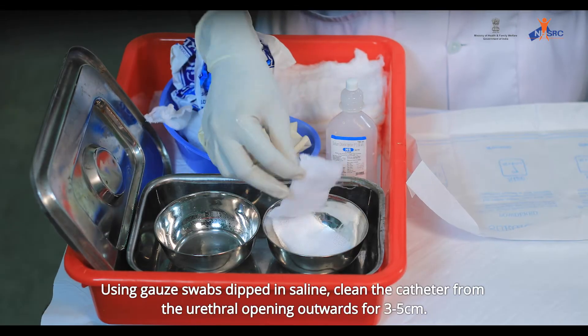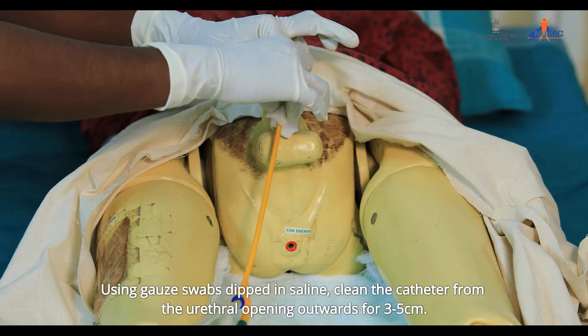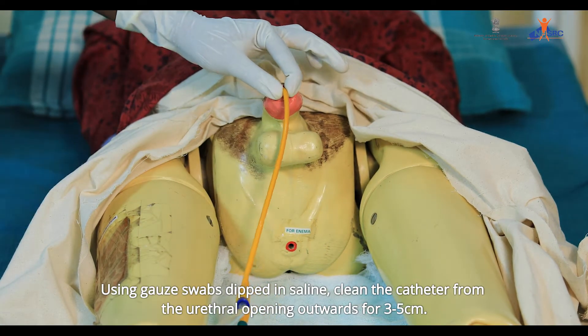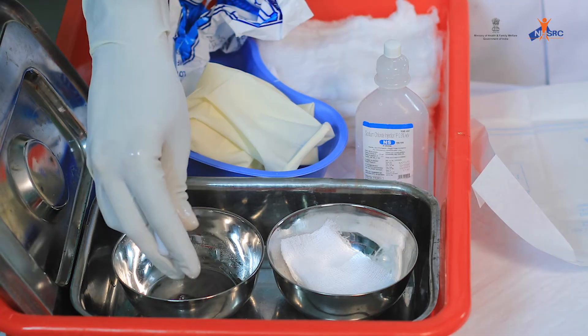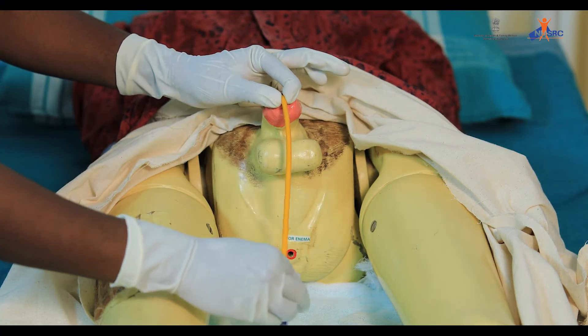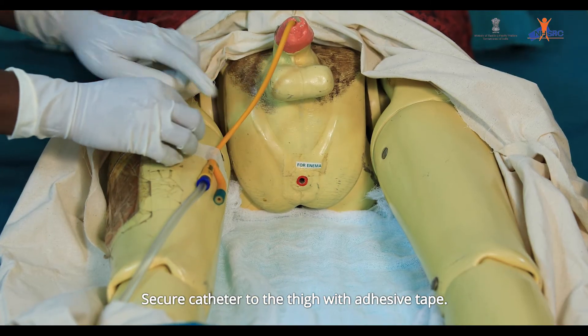Using gauze swabs dipped in saline, clean the catheter from the urethral opening outwards for 3 to 5 cm. Repeat again. Secure the catheter to the thigh with adhesive tape.